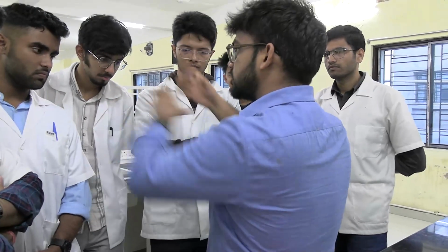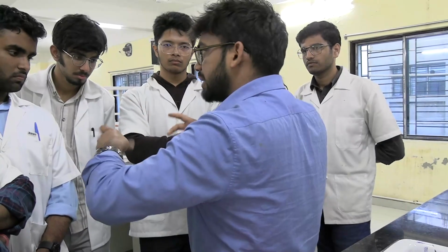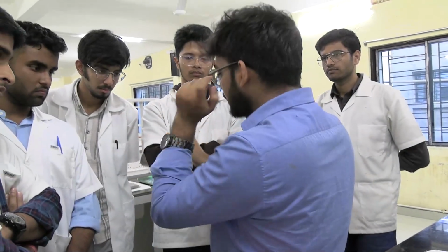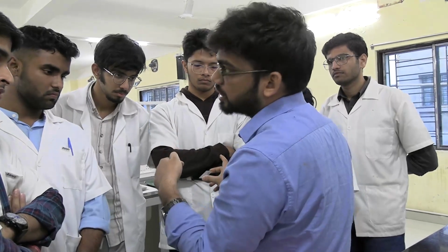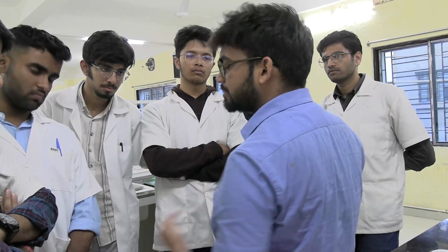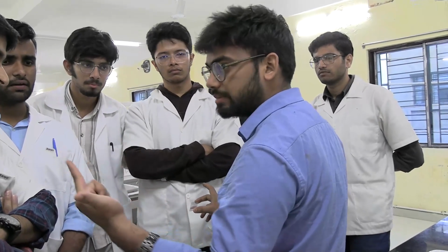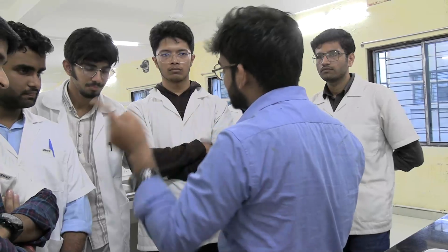Now we will change it. Let's go. Leave that cedarwood oil here. Now I am going to place it under 100x. Now the exact place only I am going to focus. And now, how to calculate? What is this method called? Battlement method. Just like the zigzag method only.